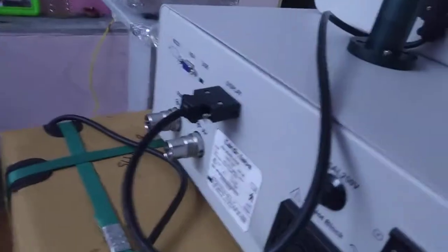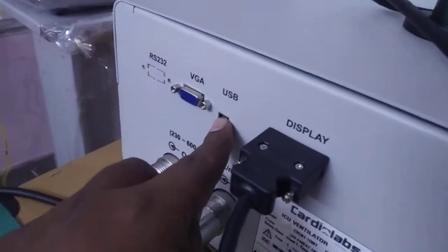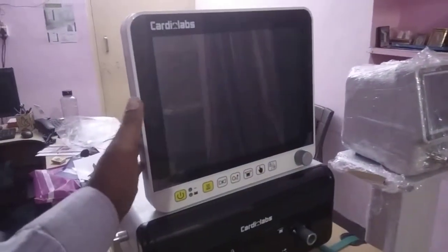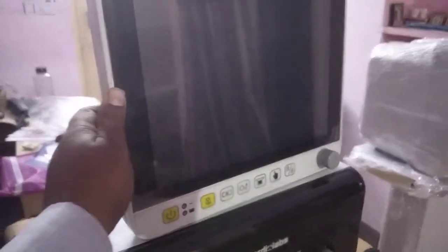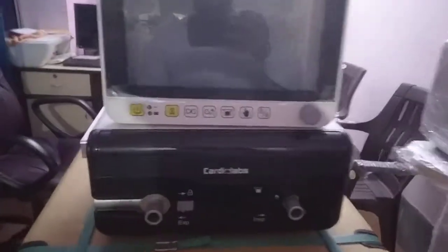This is the on/off switch for the power input. You can connect your display from here — this is an HDMI connector — or you can connect a larger display using VGA. There are also USB ports. This is your front 12.1-inch touch display, which is tiltable — you can tilt it side to side or up and down as per your viewing preference.